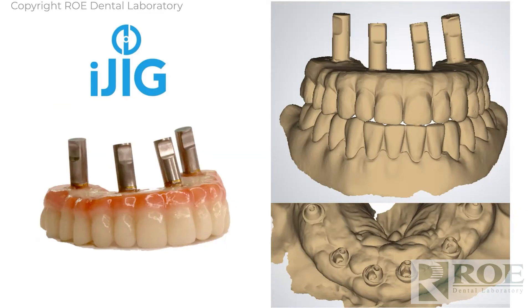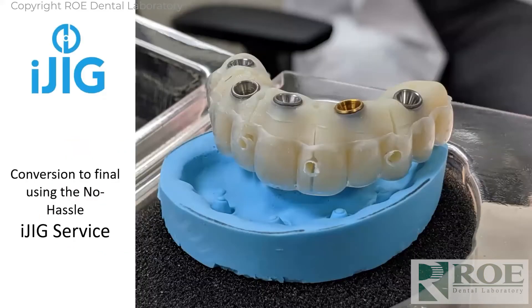Send the bottom scan off, then hold the iJig prosthetic in your fingers and scan it 360 degrees — as shown in the top right, every part of it is scanned. Then screw the prosthetic back in the mouth and scan the bite and opposing. The next case I'll show is a double arch, which is a little different, but for single arch, this is the process.